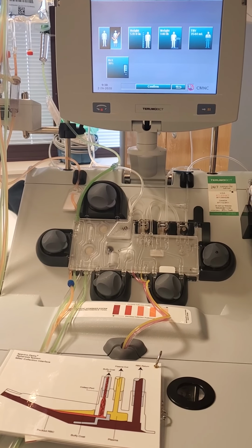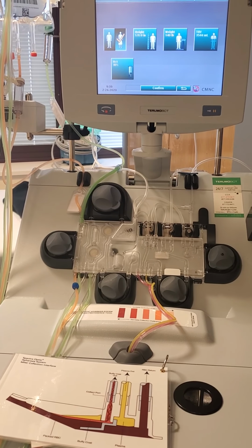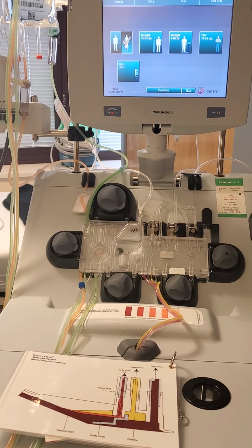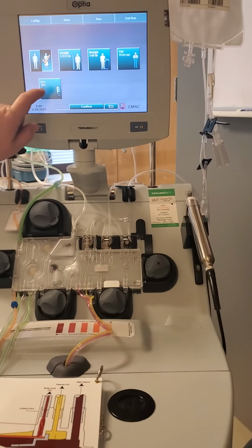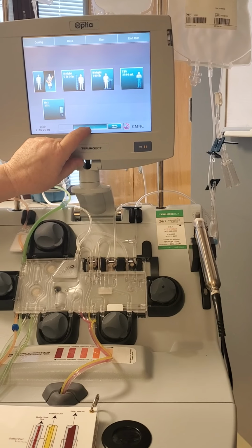But you need to get this procedure off and running, so you're just going to do what Opti is telling you to do. Okay? All right. Let's try it. Let's try it even higher. Let's try 35. And I know what will happen. I know that crit's not 35.